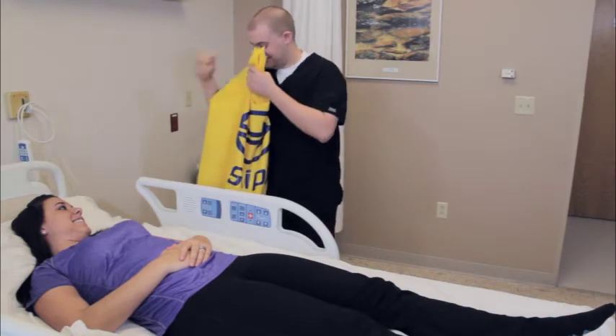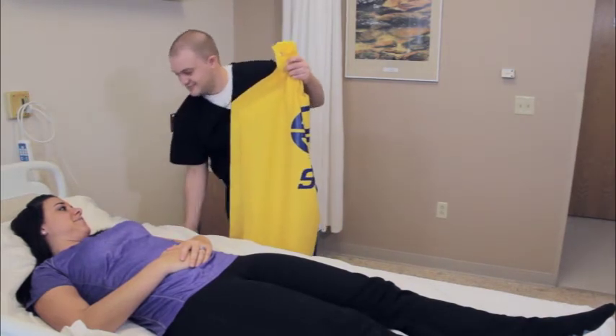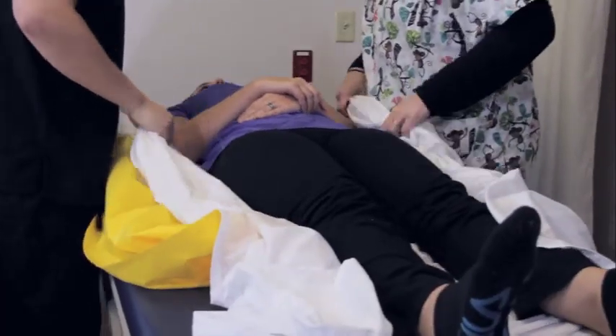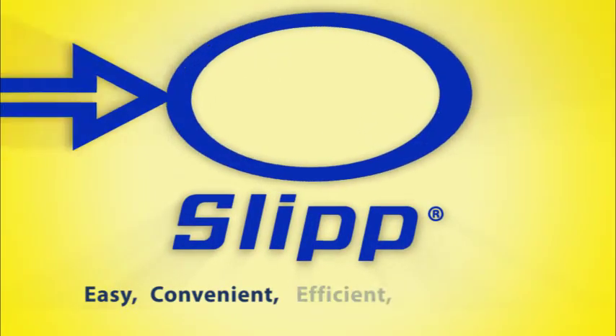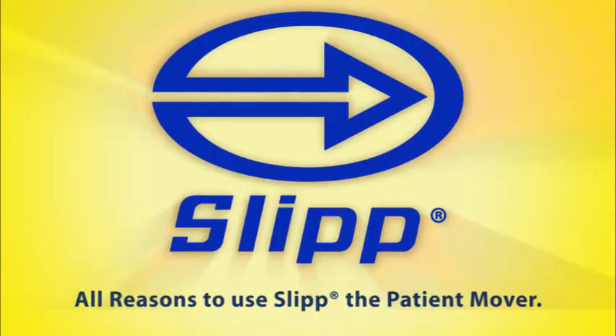As a healthcare professional, you know how important it is to make the best use of every minute of your busy day. Slipp, the patient mover, takes less time and fewer staff for patient moves. It reduces the risk of injury to staff and patients while making patients as comfortable as possible. Easy, convenient, efficient, affordable — all reasons to use Slipp, the patient mover.